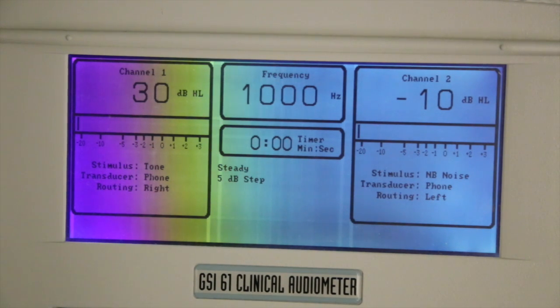If the client does not respond, increase the intensity of the tone by 20 decibels until the patient responds. Once the client has responded, decrease the intensity of the tone by 10 decibels until there is no response. Then increase by 5 decibels until a response is obtained. Lower the stimulus intensity again by 10 decibels, then repeat. We take the threshold as the level at which the patient responds in an ascending series at least 2 out of 3 times.